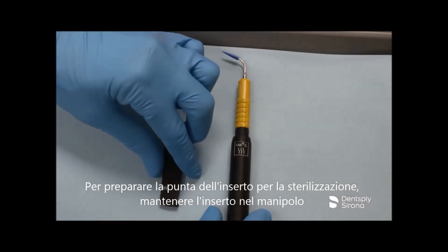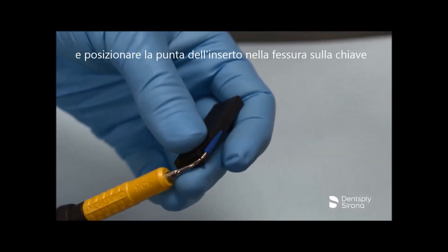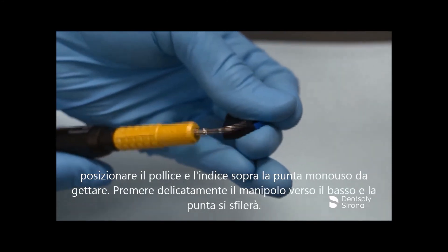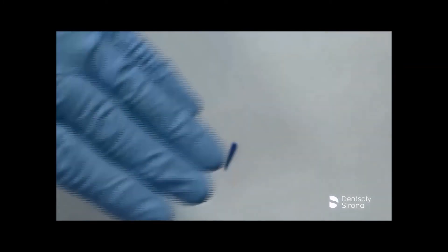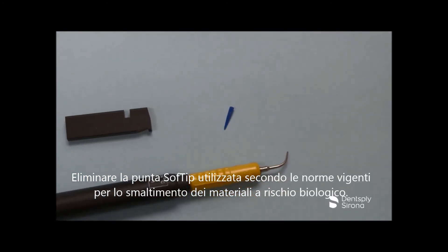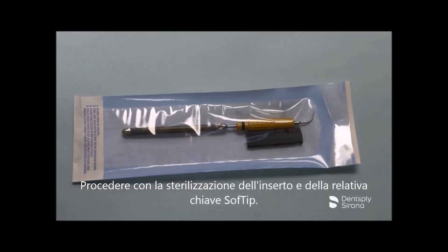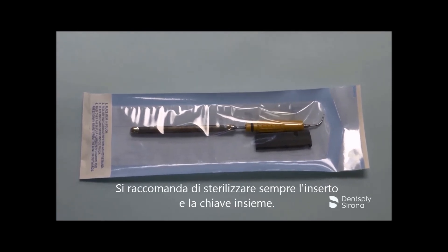To prepare the insert tip for sterilization, keep the insert in the handpiece and place the tip into the slot on the wrench. Place your thumb and index finger over the disposable prophy tip, then gently push the handpiece downward and the tip will disengage. Discard the used plastic Soft Tip Disposable Prophy Tip in accordance with applicable standards for disposable biohazard materials. Proceed with sterilization of the ultrasonic insert and soft tip wrench. It is recommended to always sterilize the insert and the wrench together.